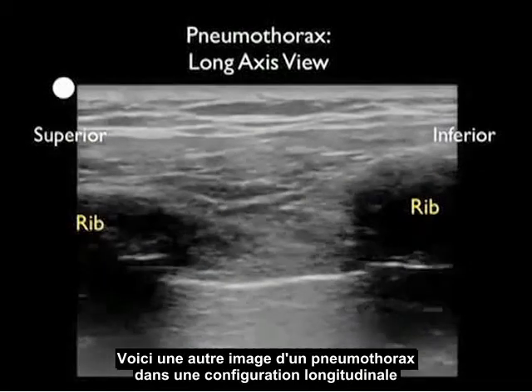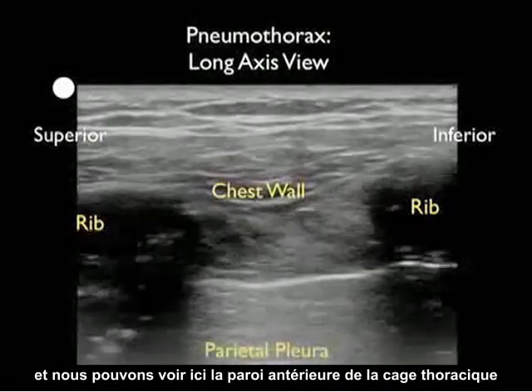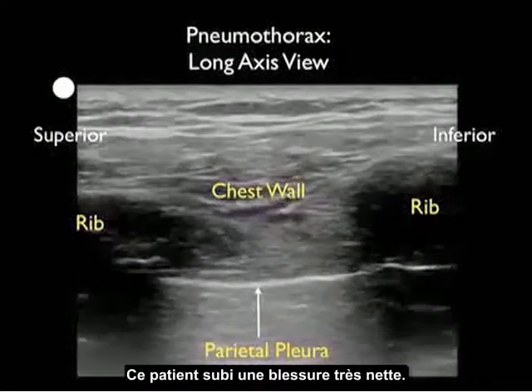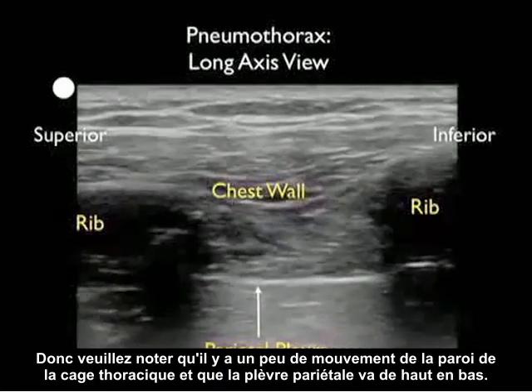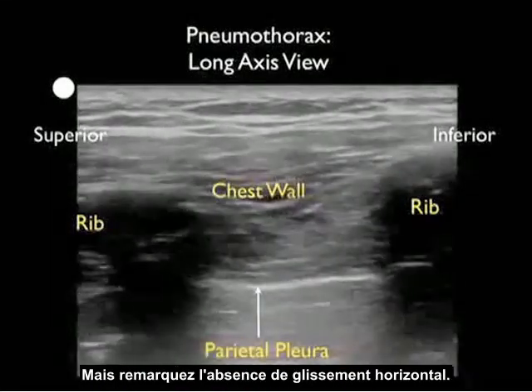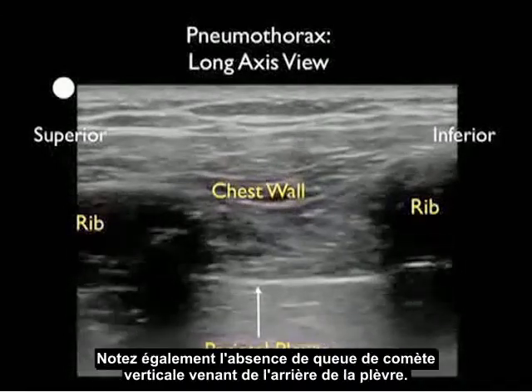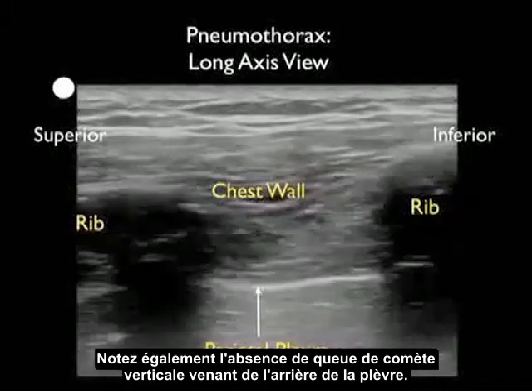Here's another image of a pneumothorax in a long axis configuration. We see the chest wall anteriorly and the single white line which is the parietal pleura. This patient was acutely dyspneic, so notice there is some motion of the chest wall and the parietal pleura moves up and down, but notice the failure of horizontal sliding. Notice also the absence of any vertical comet tails coming off the back of the pleura.